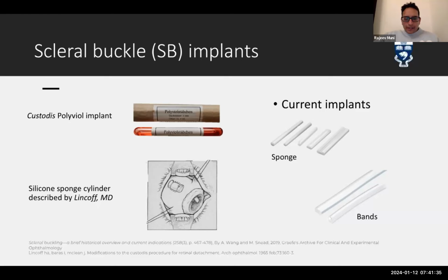which was traditionally the method used to treat most retinal detachments, even prior to scleral buckling. So all of the techniques that had come before that were working to some extent involved external drainage of fluid. And whether that involved injection of air, by Ohm in 1911, or the Gonin procedure, where they did something called ignipuncture, where they took a hot metal device basically and went through the sclera into the subretinal space, and essentially caused the retina to incarcerate at that site, with drainage.